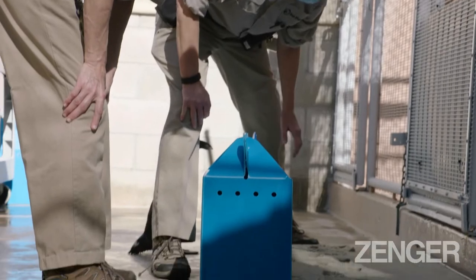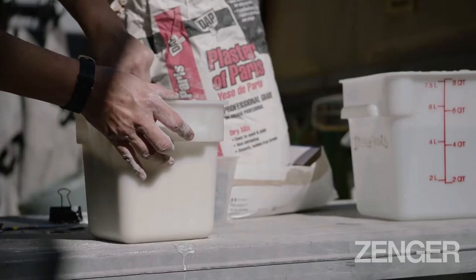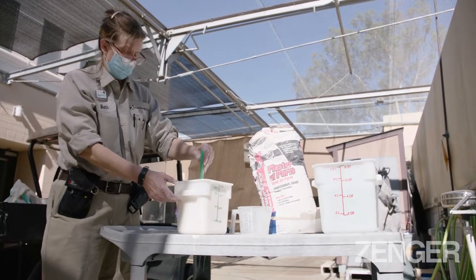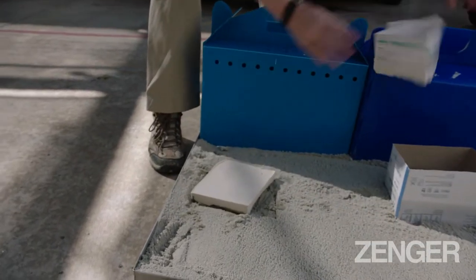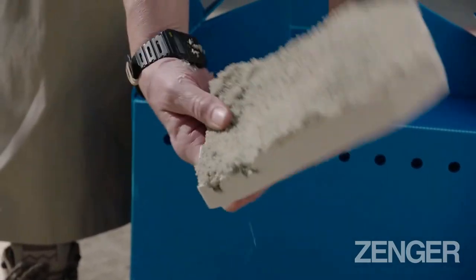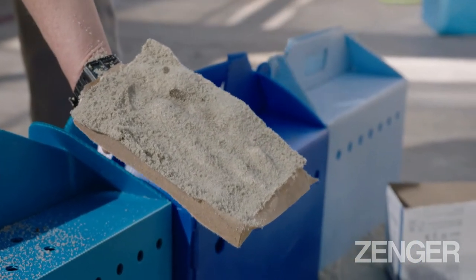You're a squirt. I was thinking one might be a lot. It's not like it's gonna harden up, so thank you. There we go. Perfect. And then we'll let this dry a little bit. Sweep off more of the sand, you get a nice outline of the foot and how he bears weight, or how much pressure he's gonna put on his toes when he breaks over.